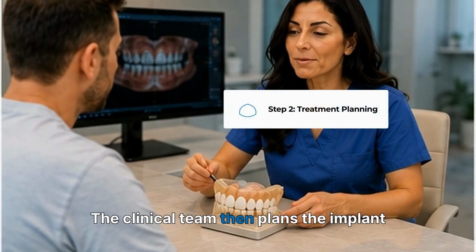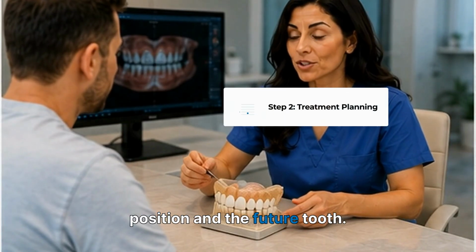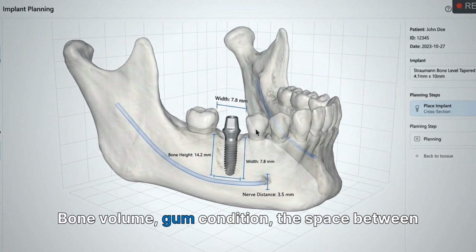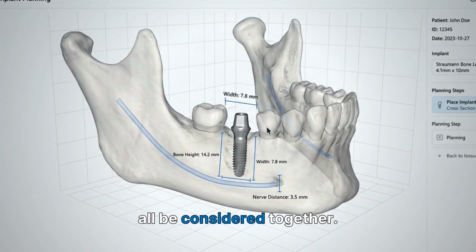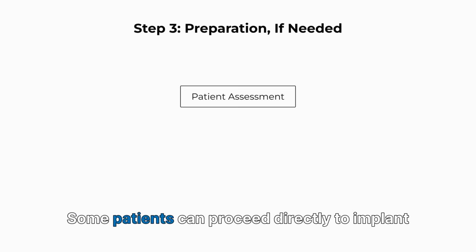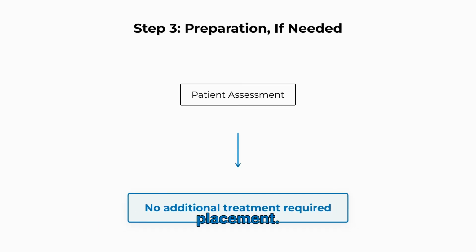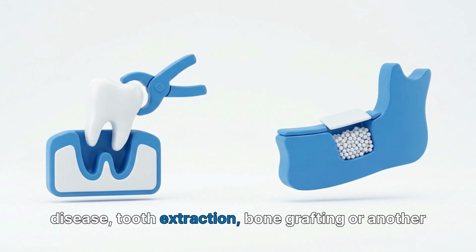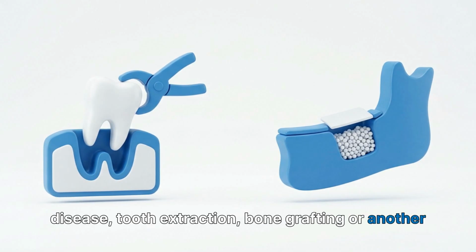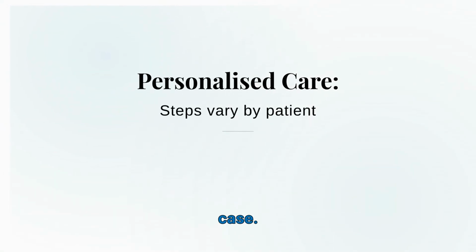The clinical team then plans the implant position and the future tooth. Bone volume, gum condition, the space between the teeth and the final restoration must all be considered together. Some patients can proceed directly to implant placement. Others may first require treatment for gum disease, tooth extraction, bone grafting, or another preparatory procedure. These steps are not required in every case.